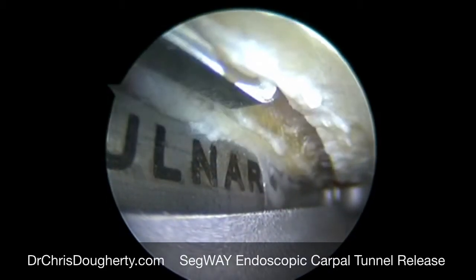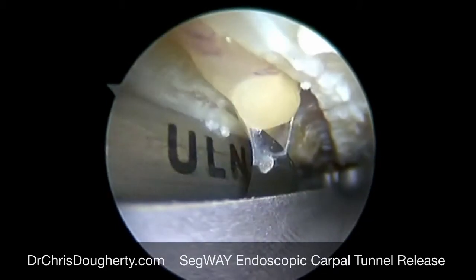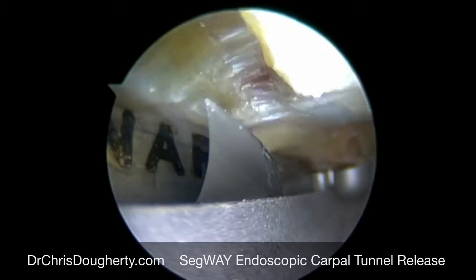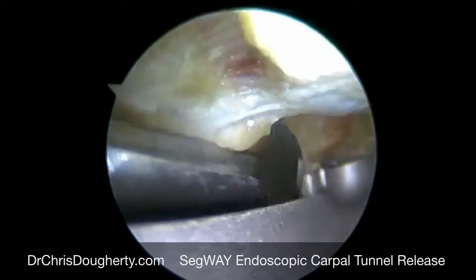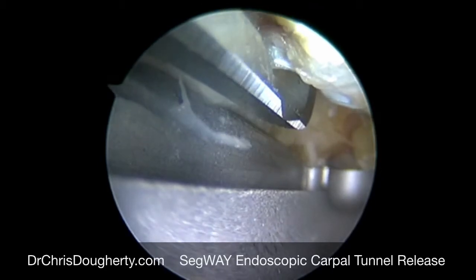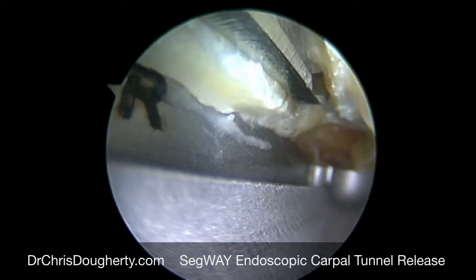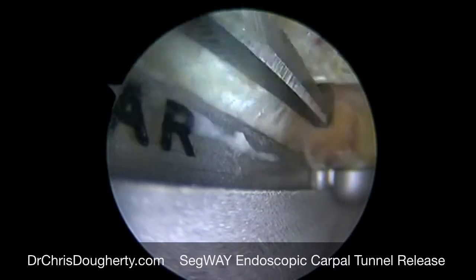The ligament itself has a very well-defined border. You can see how very thick it is here at the mid-aspect of the ligament itself. As we move back towards the other end of the ligament, we carefully ensure that we're cutting just the ligament. As we cut the fibers of the ligament, you can see how it spreads. The guide helps spread the ligament and retract it so that we can accurately cut with our endoscopic blade.